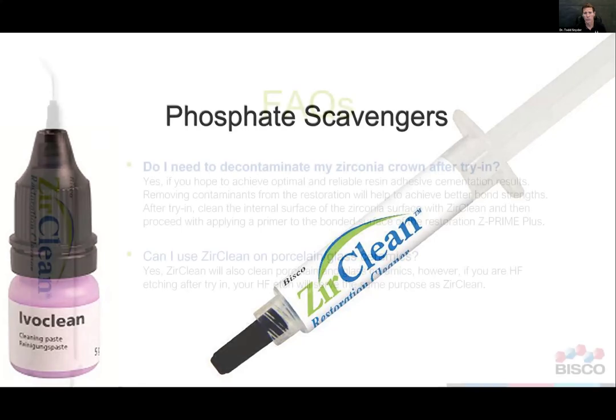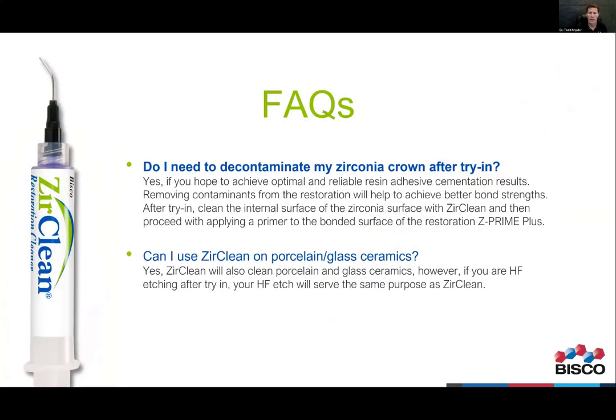So again, when you go back to answer questions, have fact sheets in front of you. This is why I put these in here. Again, straight from Bisco: do I need to decontaminate my zirconia crown after trying in? Of course you do, with any product you're using. Can I use Zirclean on porcelain or glass ceramics? Yes, you can. So you can clean all your ceramics with Zirclean as well.